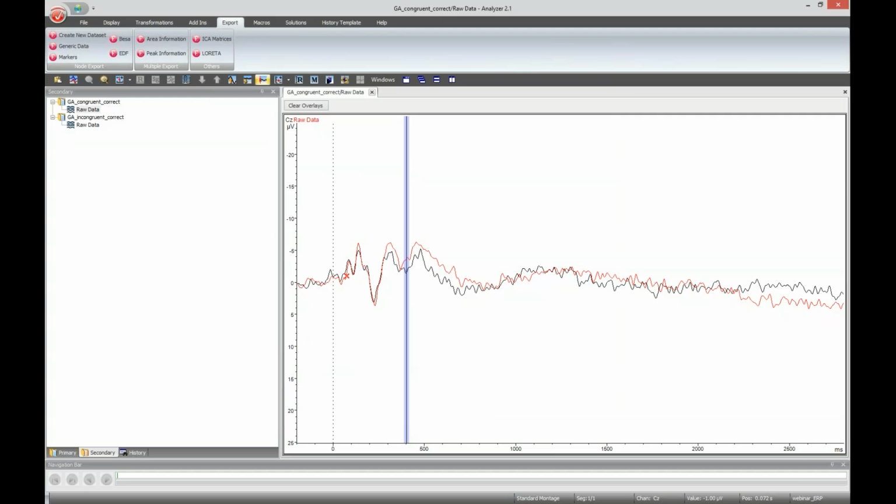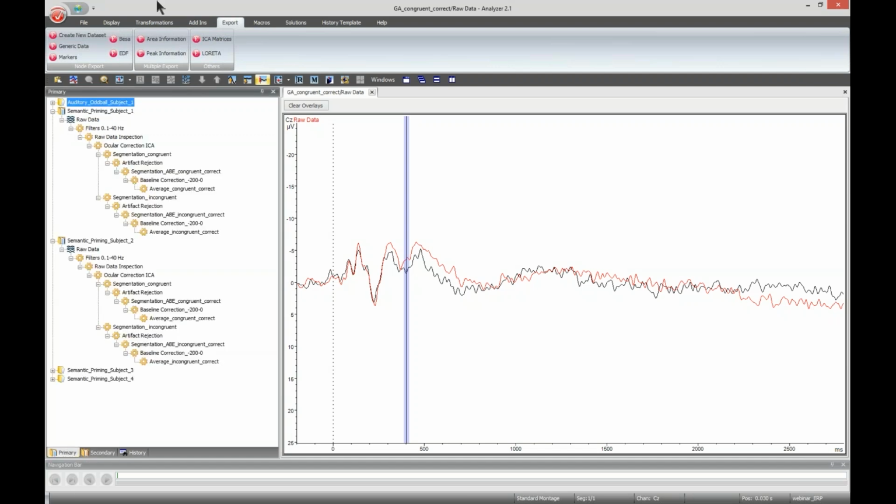Do I have to keep the same number of trials for all subjects? Of course not. I mean, you can, of course, if it's possible. There might be paradigms where this is important. Of course, it's good if they do not deviate too strongly, because this might lead to weird results, because then the power might be different in the different subjects.